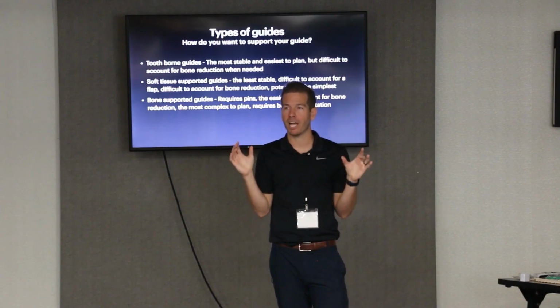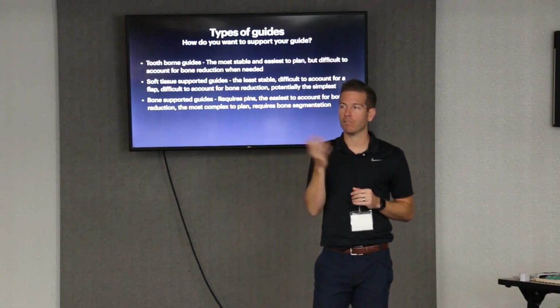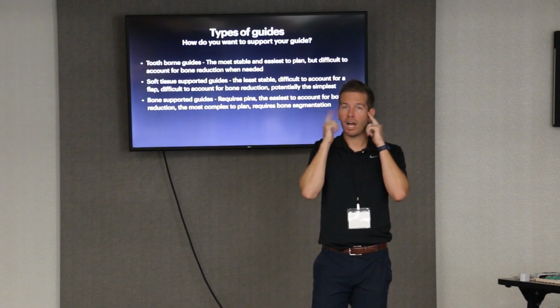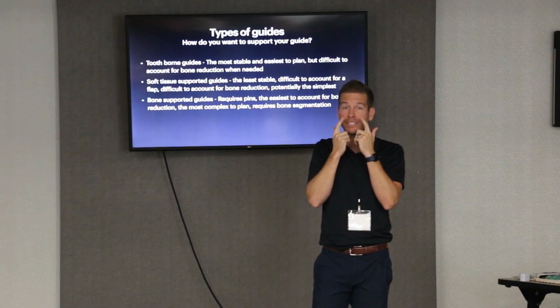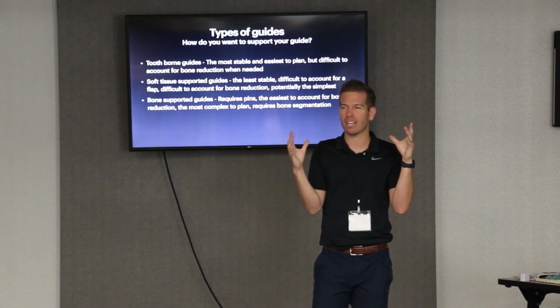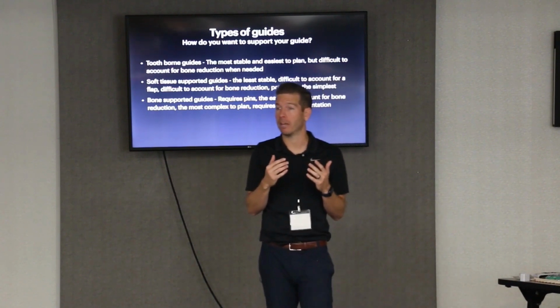to support that guide? So the case that we're going to do, for Latoya's case, she's got all 14 teeth. So think about, I'm going to leave the second molars. I'm going to leave the canines, because typically we're not putting implants in the canine sockets because it's a big socket with a thin buccal plate. It's just not a good place for an immediate implant usually, or generally you're not putting them in there.